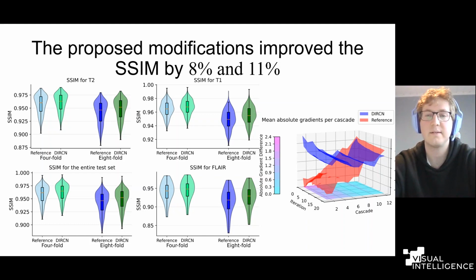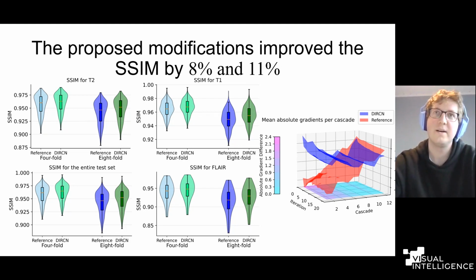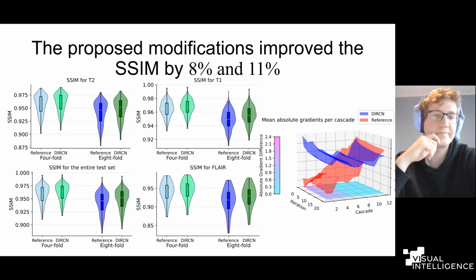So it's quite a significant improvement. But you also have to keep in mind that the reference model we used, with the baseline reconstruction methods, is quite good to begin with. So it might sound like a lot, but visually it's not that different, because the networks are already really good.